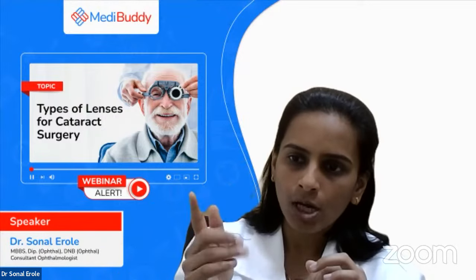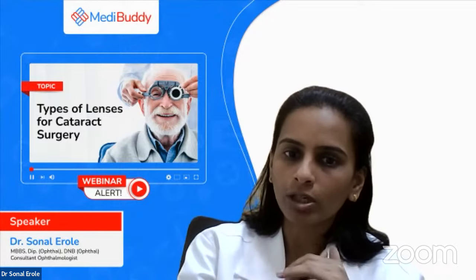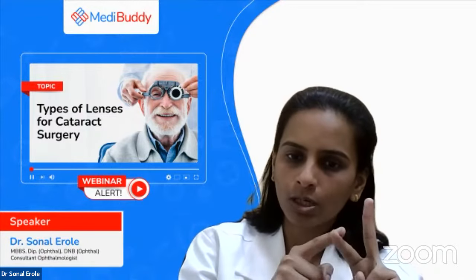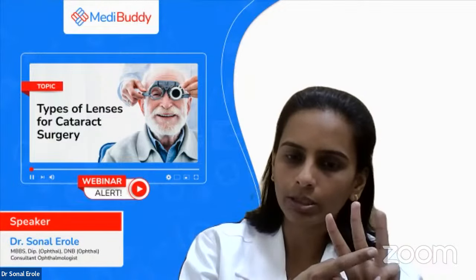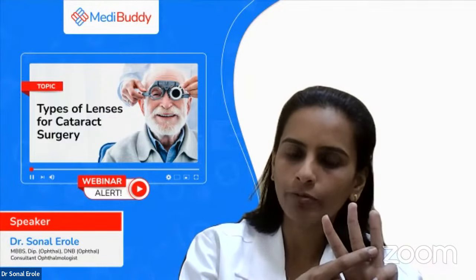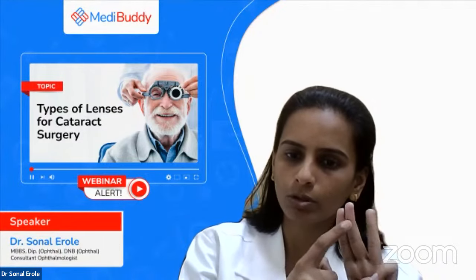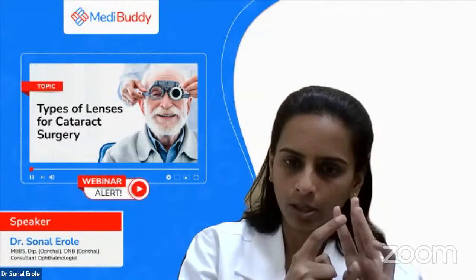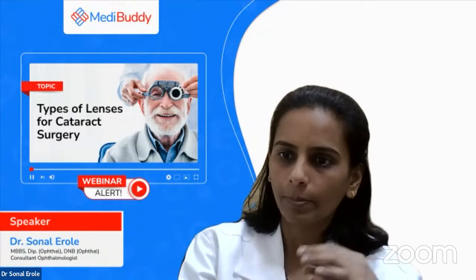If you are talking about intraocular lenses, then there are two types, multifocal or extended depth of focus, or, in our newest concept, trifocal also. Trifocal will have all the properties of multifocal and extended depth of focus, and will have reduced night driving problems and color contrast sensitivity problems.